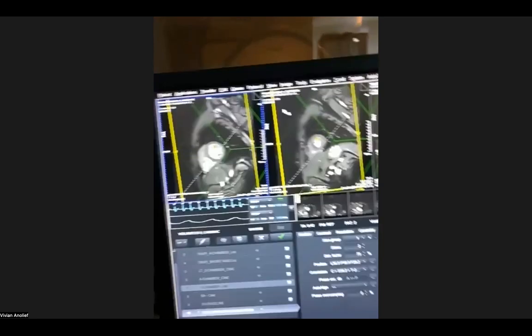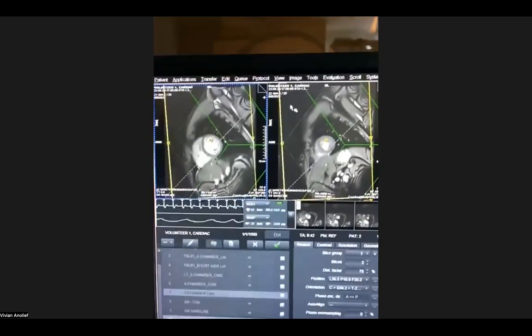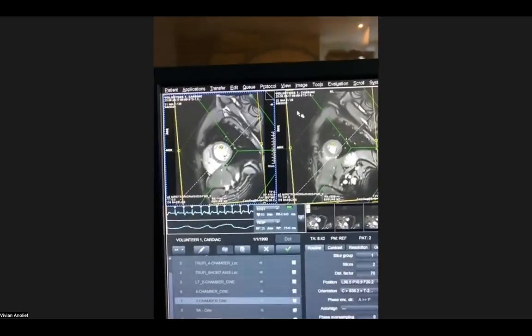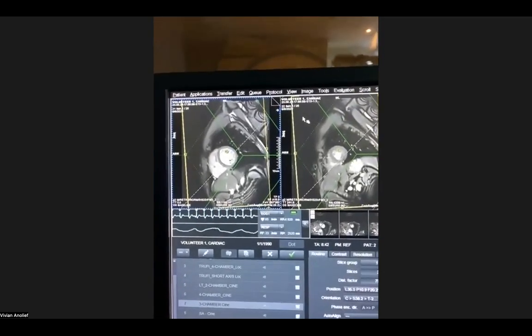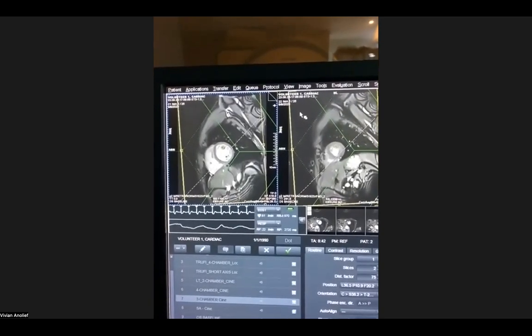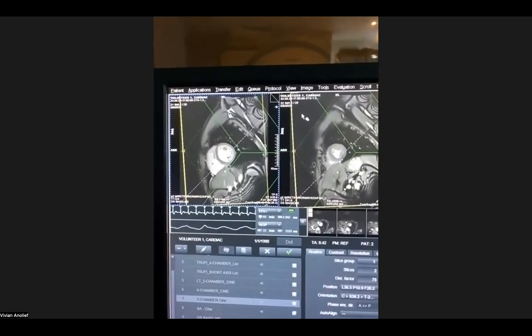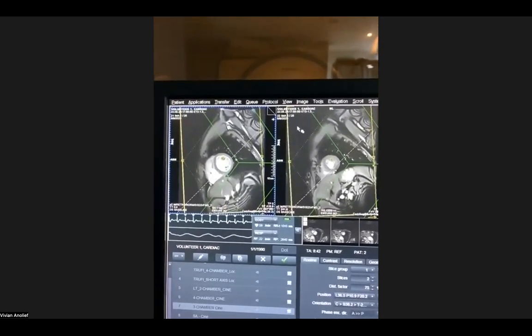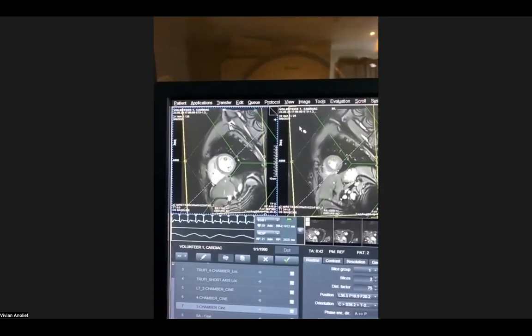Hello, Joseph, can you hear me? So we're about to start with the one with a breathing instruction. So you will hear the beep. The first one, just 1 minute, breathe normally, just breathe normally as you do. And then it will start asking you to hyperventilate, which implies you breathe in well, breathe out well, and make it as fast as you can.